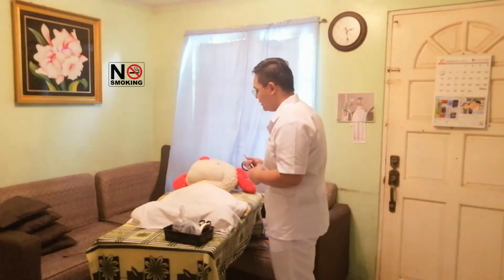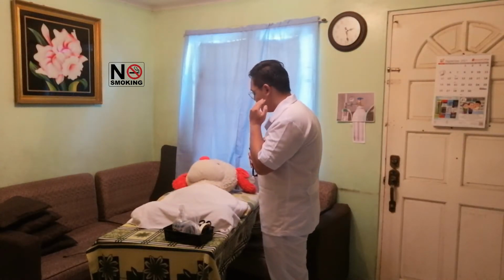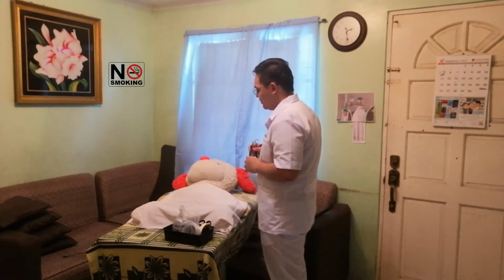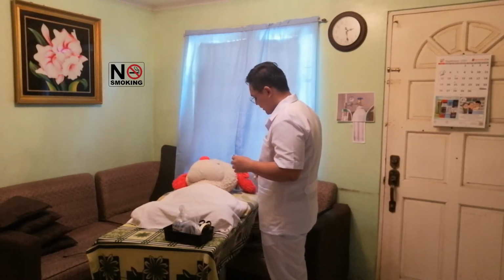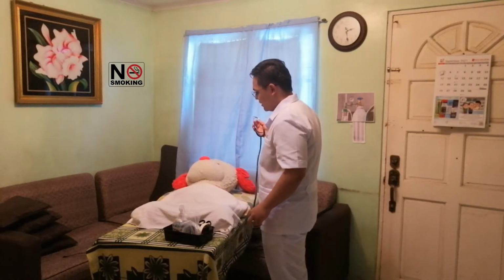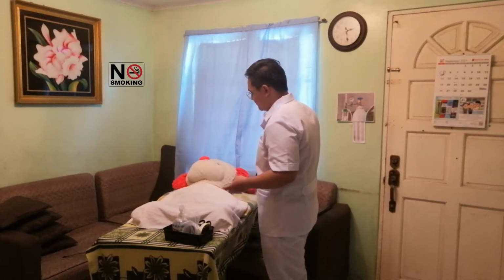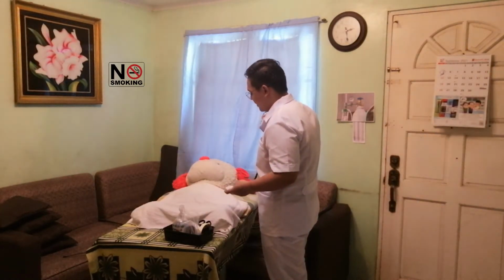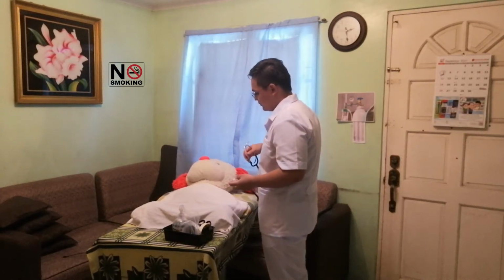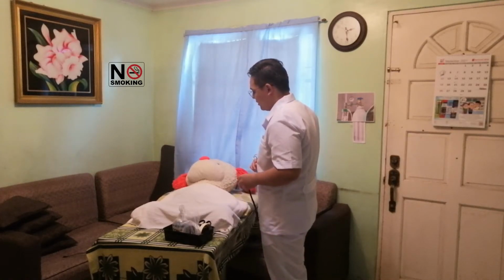So good day po ma'am. My name is Christina Lamsmang and I'm a student nurse po from Tarlac State University from BSN 2B. And I will be your nurse for today po. So for today po ma'am, assess ko lang po kayo. Okay lang po. Check ko lang po yung inyong pong skin color as well as yung ating pong kulay ng mucous membrane. Okay po. And also i-check ko lang din po yung inyong pong paghinga. Is that okay? Okay.